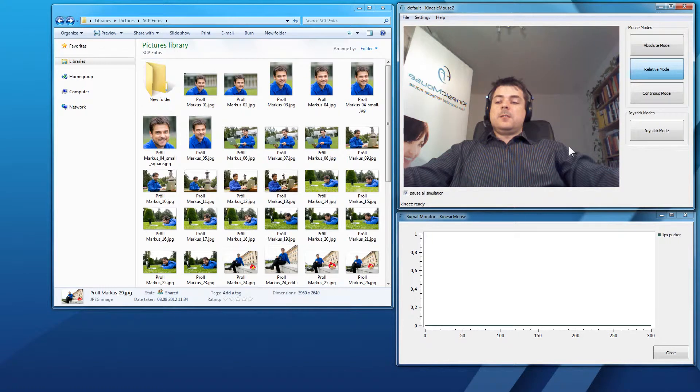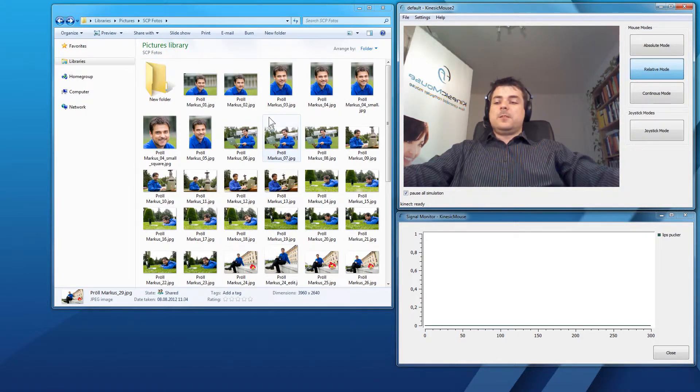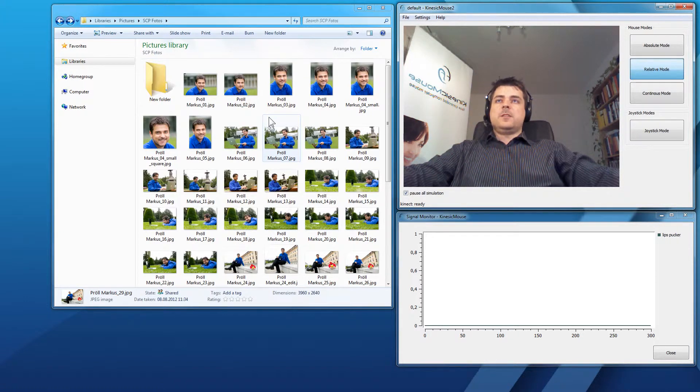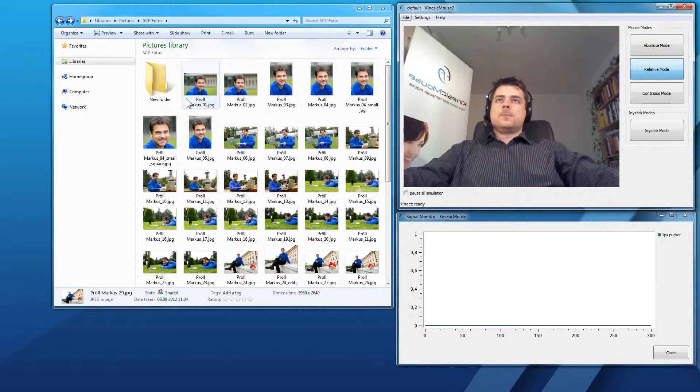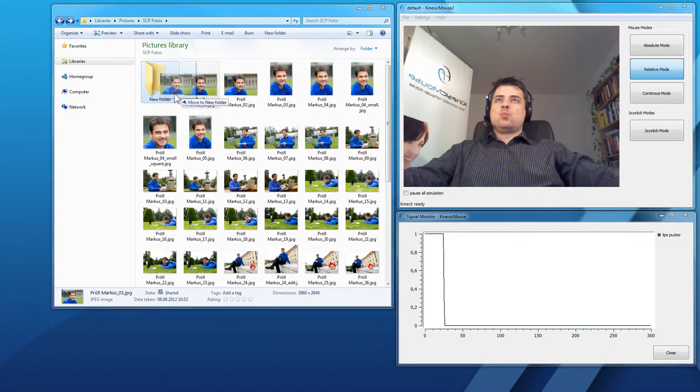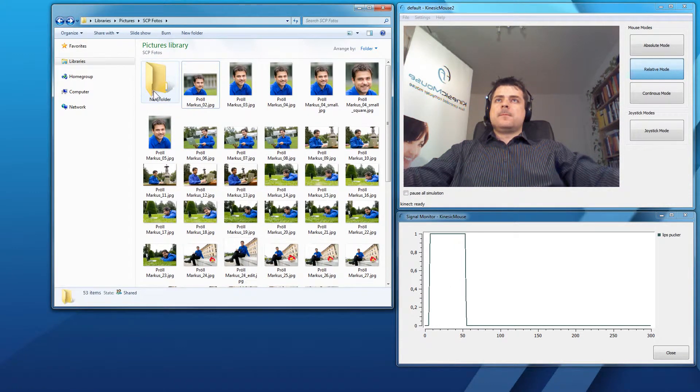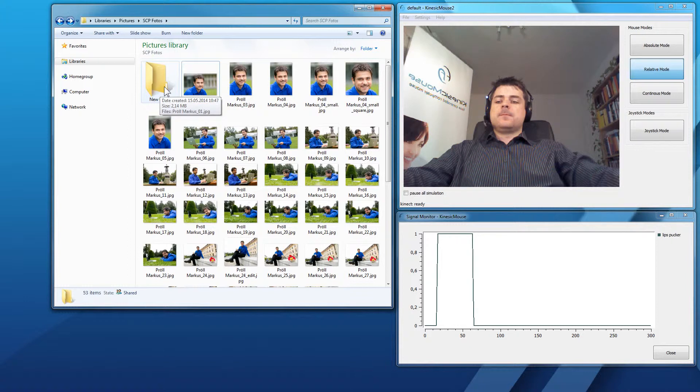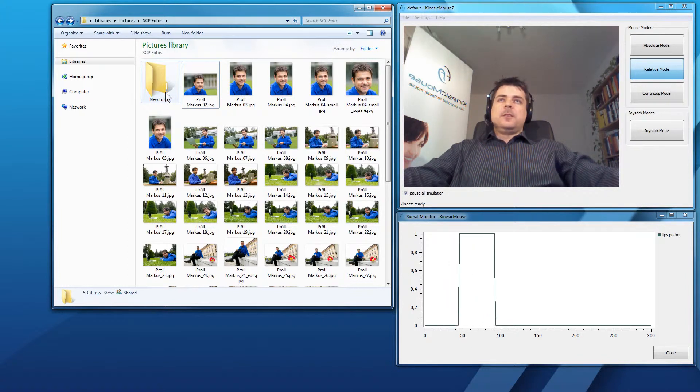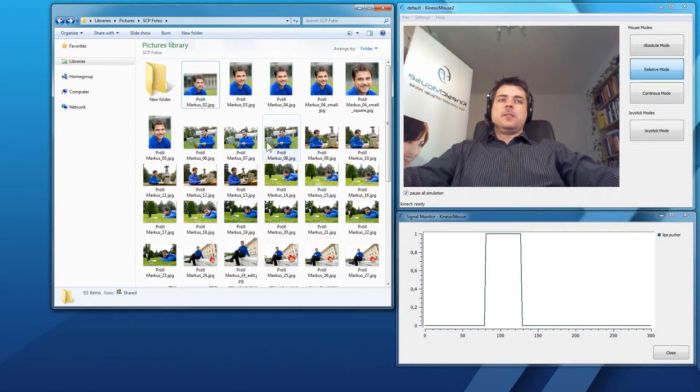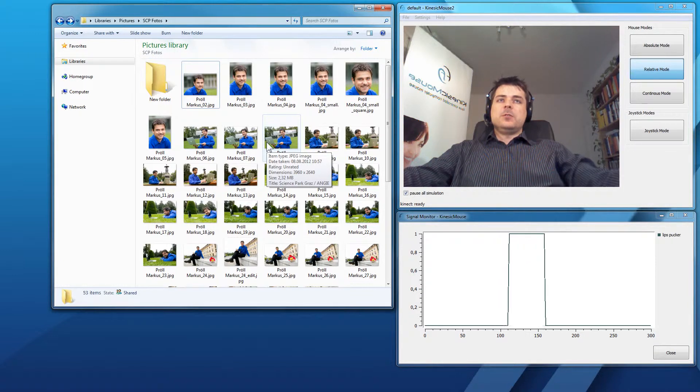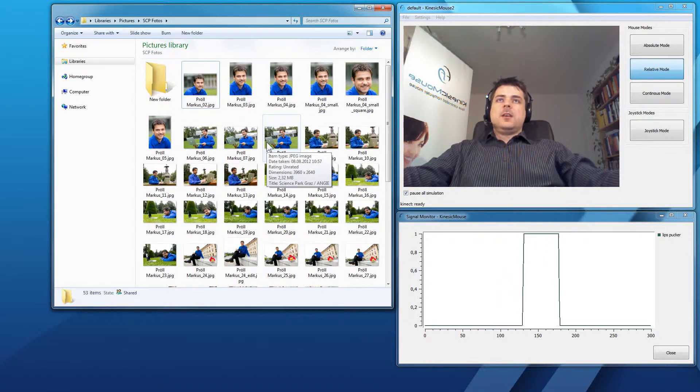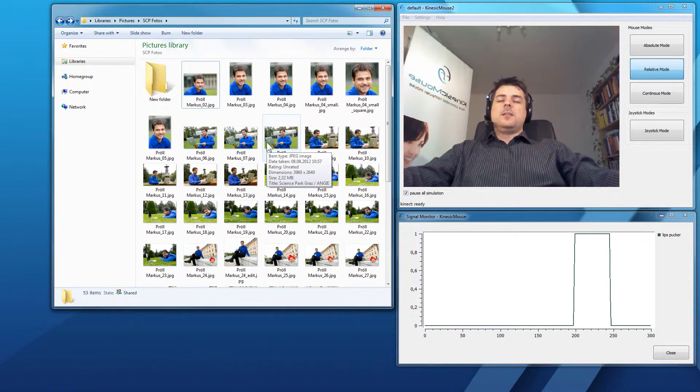I hit Alt 1 to give control to the KinesicMouse and let's see how I can click and drag this picture to the new folder. Alt 1 again to disable the KinesicMouse. So, you have seen I have to hold the expression while I'm dragging the item.